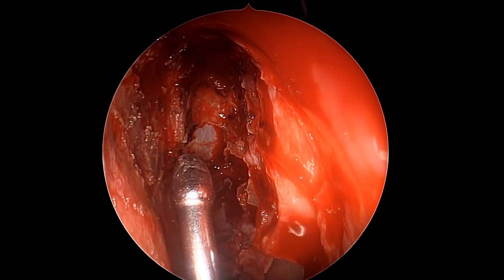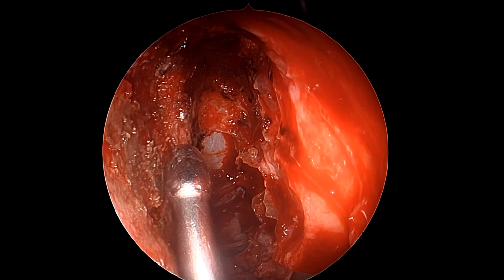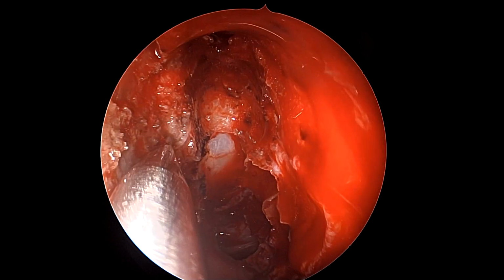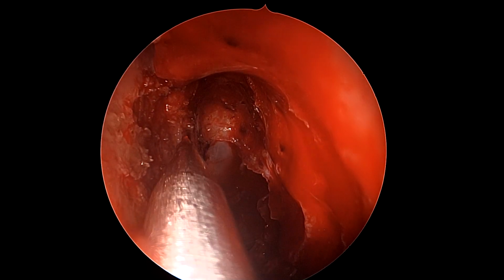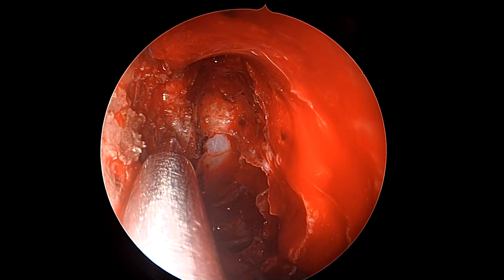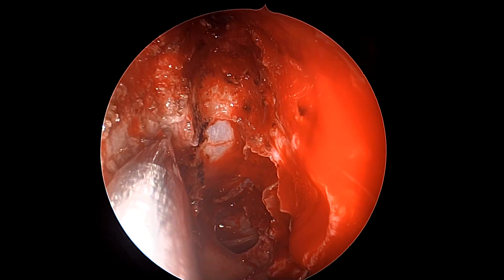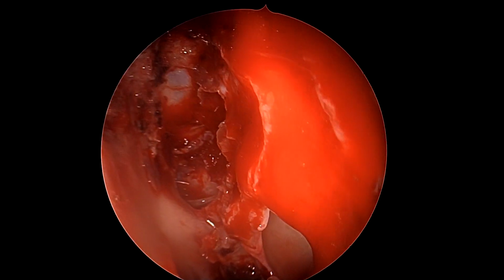Now we are using a 70-degree angled endoscope camera pointing upwards, and that in our practice has been quite handy in this part of the surgery once we have done the ethmoidectomy and most of the procedure, because then even the slight deviation of septum does not bother us because we are looking upwards. So again, reiterating the defect site with the navigator probe to make sure that we are right. Sometimes in a very small defect, it gets occluded and you're not able to make out the original site. And now that we can feel the slight defect with your instrument, you keep the fat ready to be placed here.